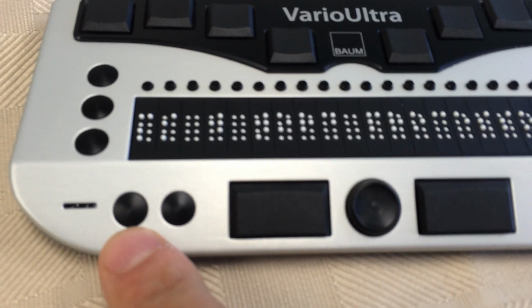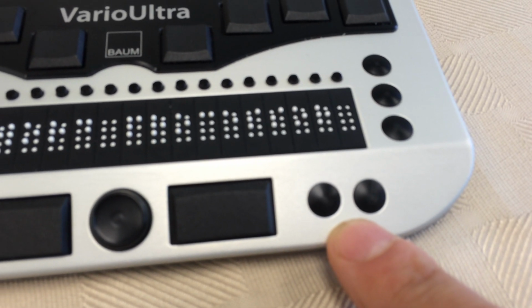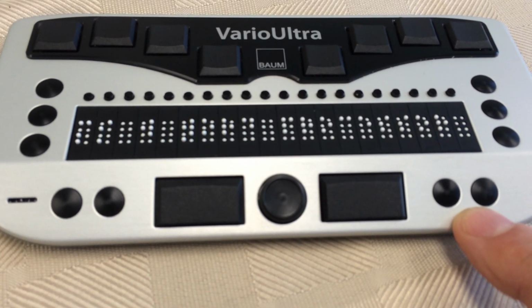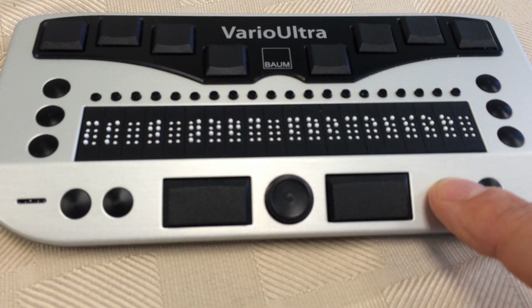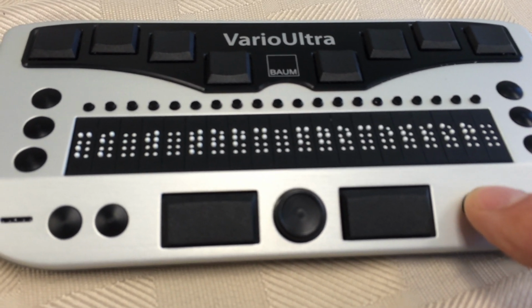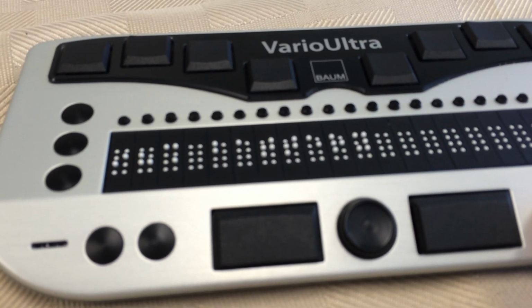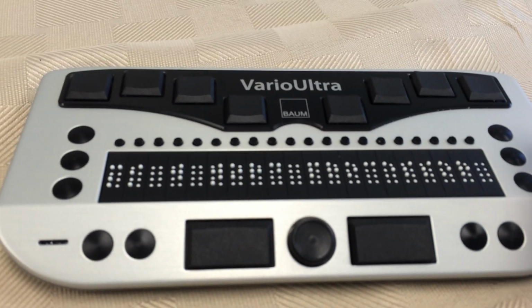Now, to the left of the left spacebar and to the right of the right spacebar, we have the system buttons. So S1 and 2 on the left, S3 and 4 on the right, and these buttons are used to access a number of things. S3, actually, if you're in the note-taker mode, will get you into the main menu. For example, if I press it twice, it actually shows me different information. In this case, it's just showing me the battery level of VarioUltra. And so again, there's a lot of access to commands there.